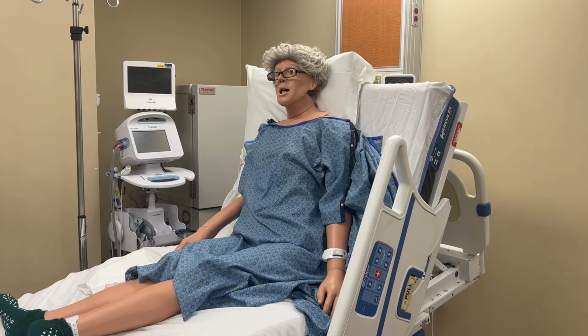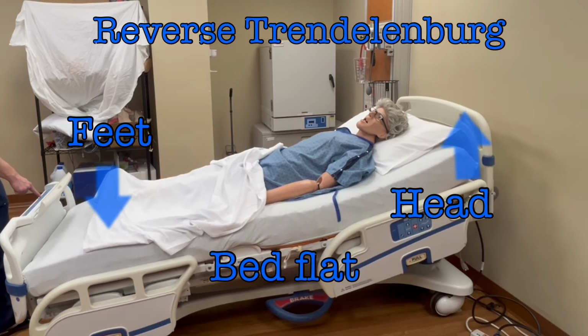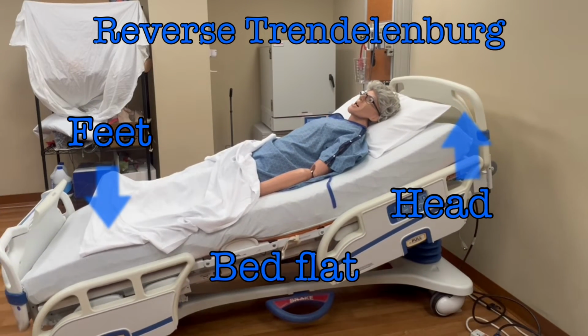After explaining the procedure, assess the patient. Sit the patient upright, as high as they can tolerate. If sitting up is contraindicated for the patient for some reason, consider a reverse Trendelenburg position.